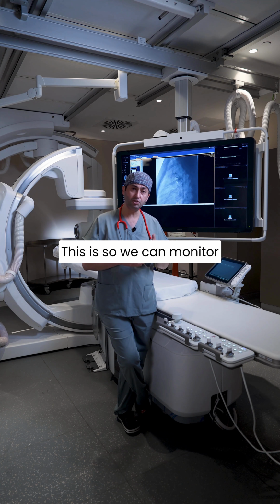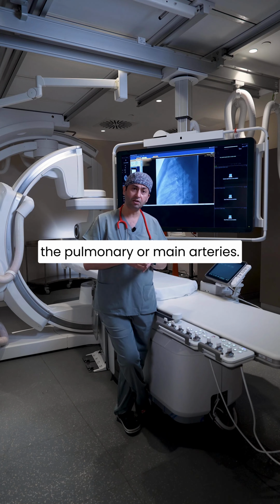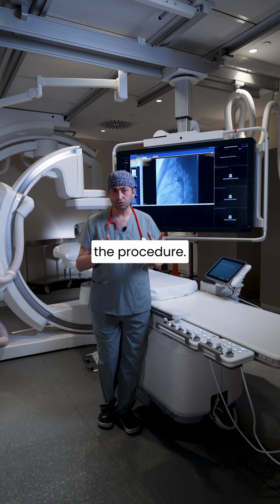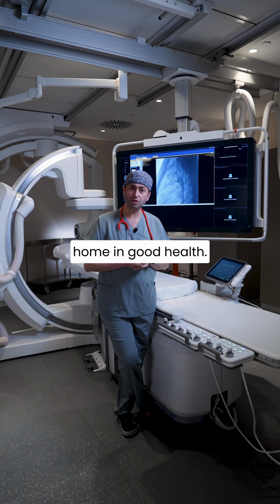This is so we can monitor for any complications such as bleeding or narrowing in the pulmonary or main arteries, as we discussed before the procedure. After performing an echocardiogram the next day, we discharge the patient home in good health.